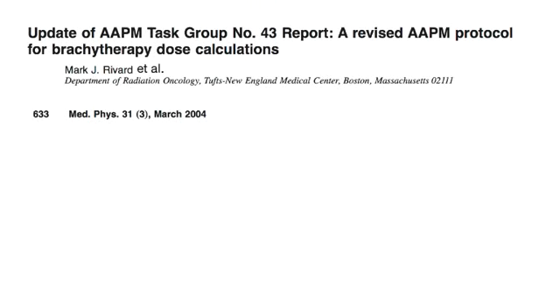We're going to calculate the dose through the AAPM TG43 protocol. This is the revised version, published in 2004. So TG43 says that the dose rate from a brachy source, you start with the air kerma strength in units of U, and multiply by the dose rate constant. Now that's specific for each brachytherapy source, and it has to be measured or provided by somebody.